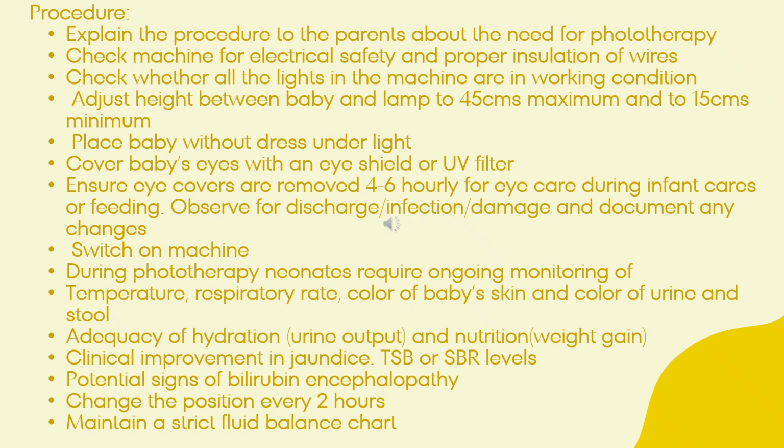Then explain the procedure to the parents about the need for phototherapy. Check the machine for electrical safety and proper insulation of wires. Check whether all the lights in the machine are in working condition. There are two types of phototherapy machines, single surface phototherapy machines and double surface phototherapy machines. According to the bilirubin level, the doctors will suggest which type to go for.